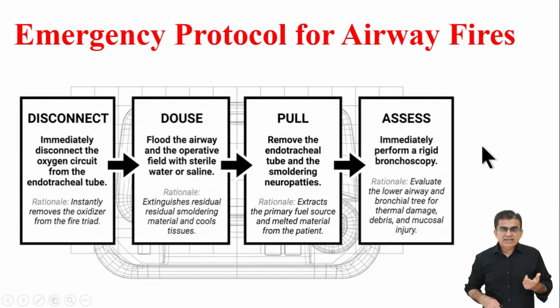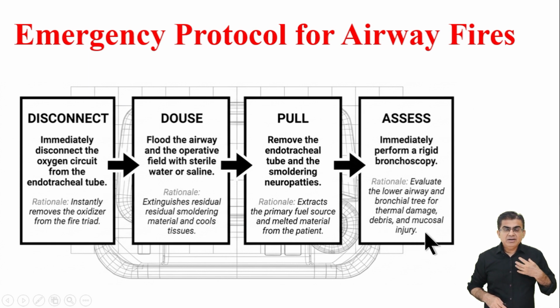Finally, look at the last step on the right side. You must immediately perform a rigid bronchoscopy. You must carefully look deep into the lower airways and bronchial tree. You must actively check for any deep thermal burns, melted plastic debris, and severe mucosal injury before doing anything else.